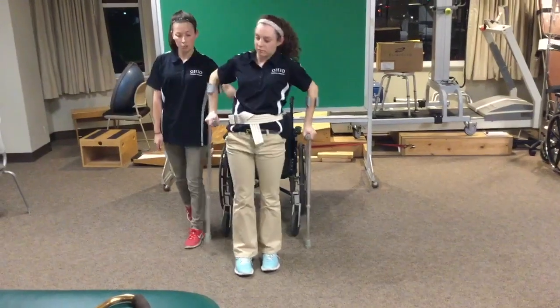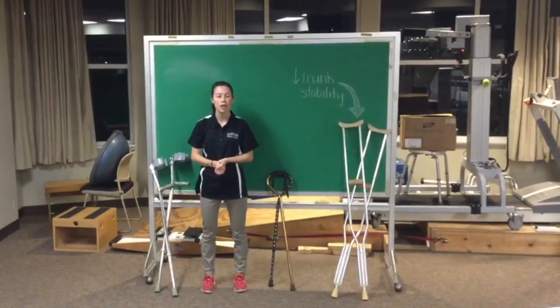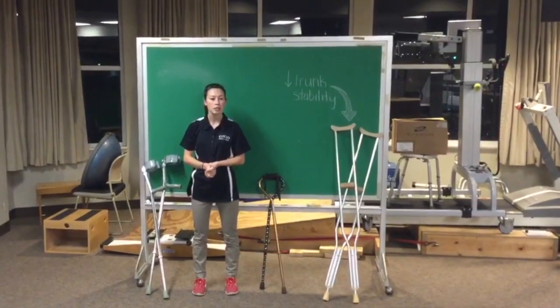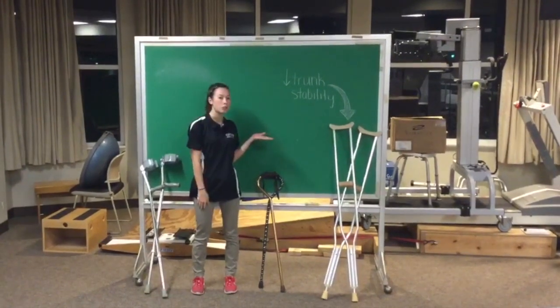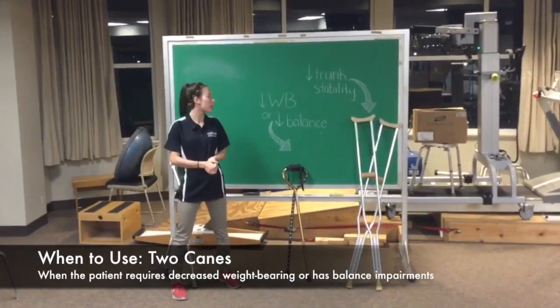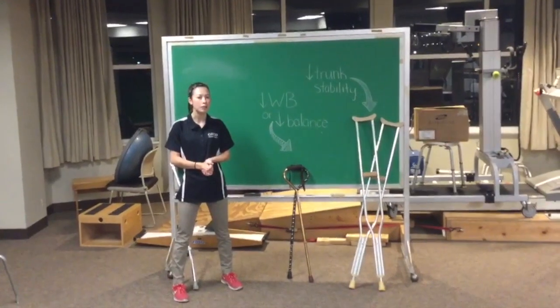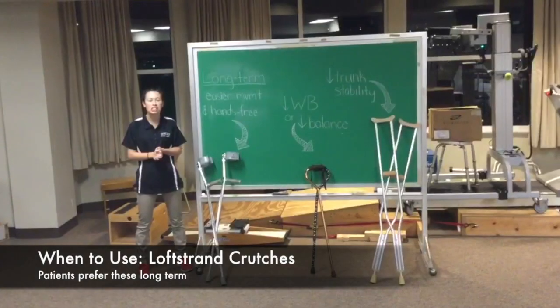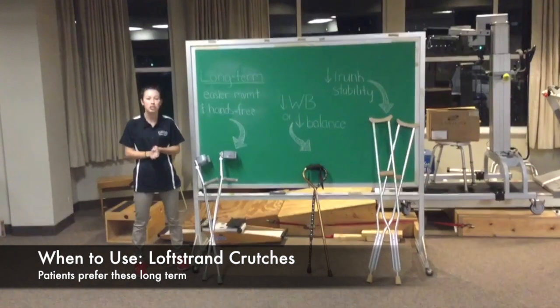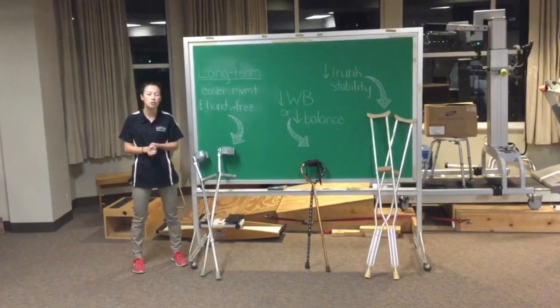They're just going to move the crutches forward so that they're in a more stable position. Forearm crutches can be used for patients with the same impairments and gait patterns as those who use axillary crutches, with the exception that those who have decreased trunk stability will have to use axillary crutches. Canes can be used for those who require slight decreases in weight bearing or who have decreased balance, but they provide limited stability. Forearm crutches can decrease weight bearing by shoulder depression and elbow extension, and are preferred long-term by patients because they provide easier maneuverability and the ability to use the hands without dropping the crutches.